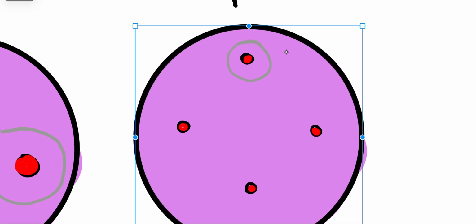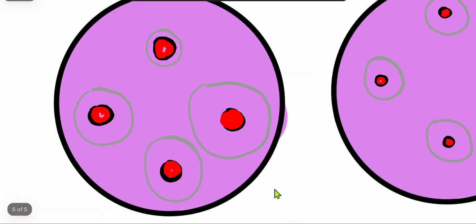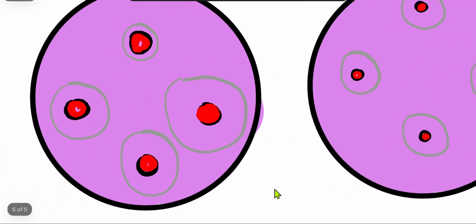Now how do I draw this? The similar kind of concentration I'm getting, suppose here also I got, here also I got, and here also I got. Now I can easily compare it with this one, and I can say where my concentration of antigen lies, in which range. So it is more or less a comparative kind of immunodiffusion.